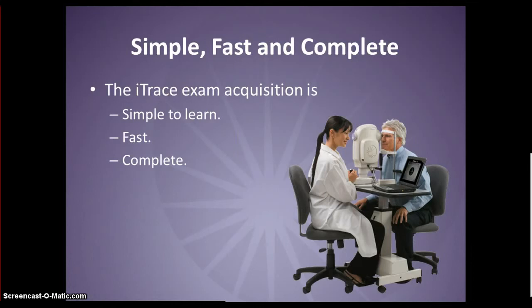Again, technicians tell us in about a minute or less they can have a complete profile on that patient's topography, wavefront, autorefraction, day to night vision, pupillometry, white to white, and a variety of other information. It's complete. And many of the clinical applications that show you this data and display it are going to be covered in future webcasts. So you see, it really is simple, fast, and complete to use an iTrace.